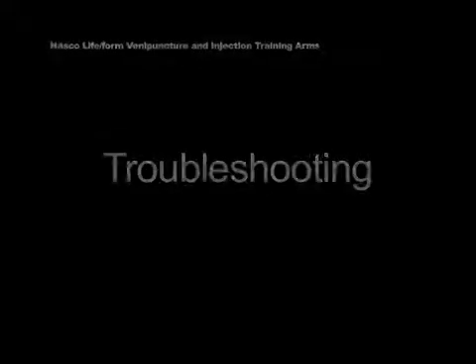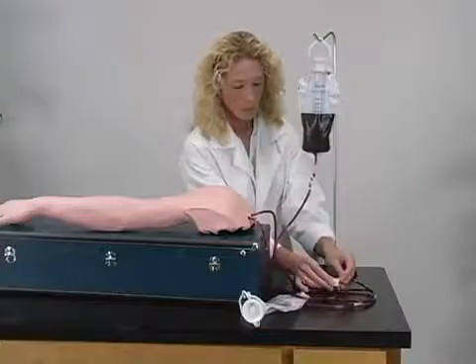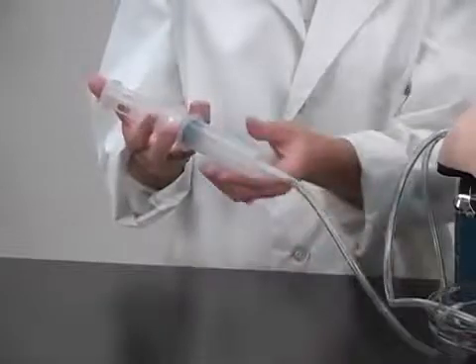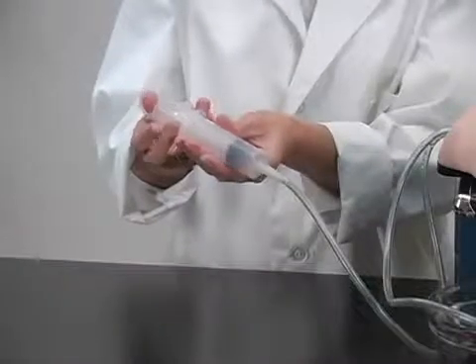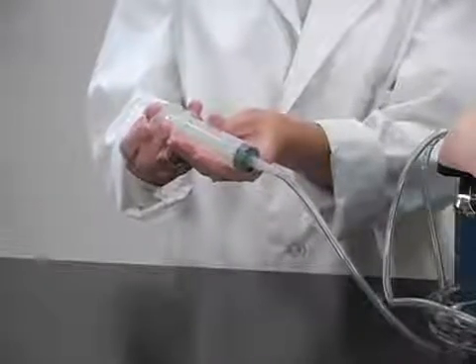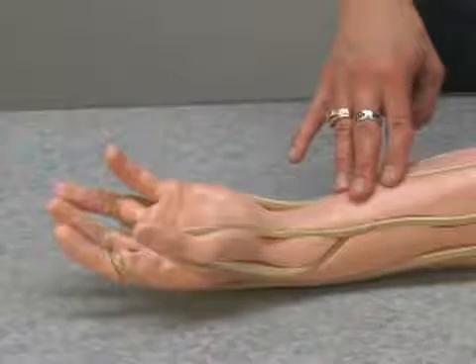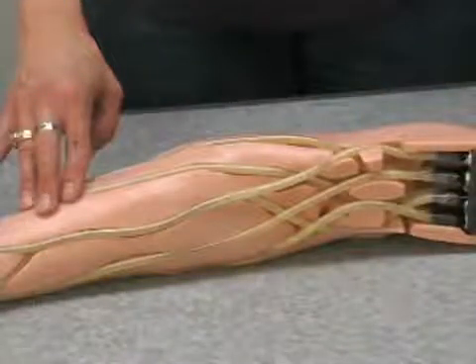If the synthetic blood is not flowing through the arm, first check to make sure the arm is properly connected and pressurized. If the arm is clogged, attempt to clear the clog by using a large syringe and injecting water into the vein. If neither of these work, a vein may be pinched closed inside the arm — remove the outer skin layer and inspect the veins for any problems.